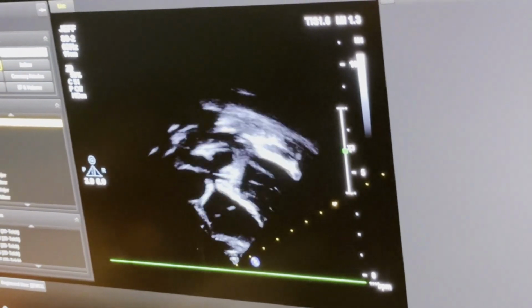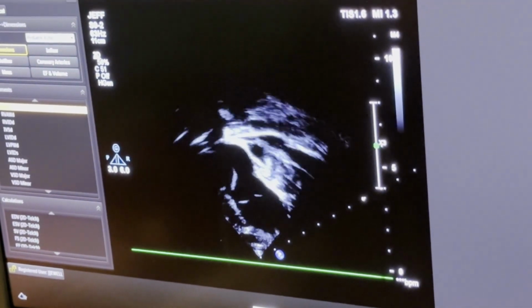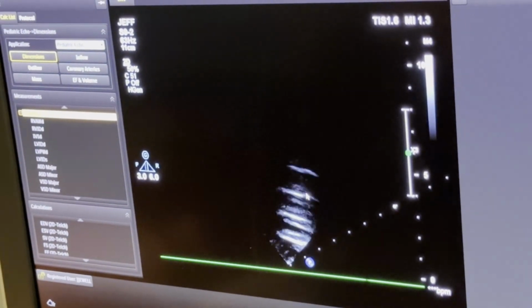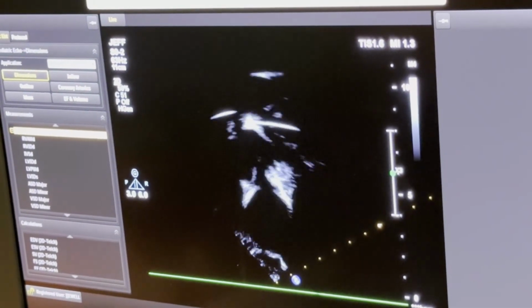And now as he breathes out and we kind of get our bearings here, we can see this is the left anterior descending, coursing all the way down through here, of course going through the entire front portion of the heart since it is anterior.